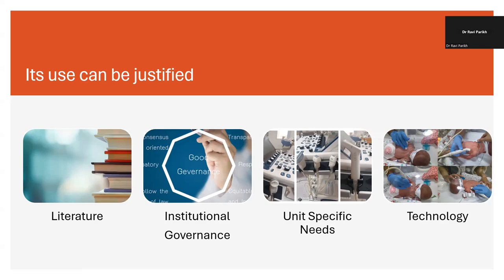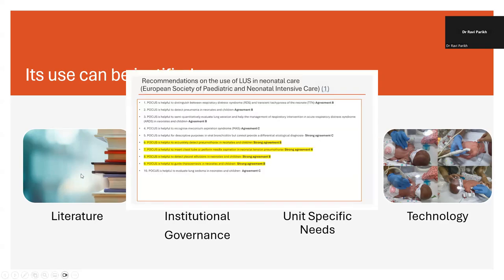And during the training period and even afterwards, if you feel that that's going to justify your use of lung ultrasound, make it easier, keep you protected, then use it. But also remember that there are some areas of evidence that don't necessarily endorse lung ultrasound as a high quality diagnostic tool. And really what I'd say is that that's very well espoused in the guidance for the European Society of Pediatric Neonatal Intensive Care, and that there's absolutely no doubt of its ability to diagnose and treat pneumothoraces and help with insertion of chest drains. In my mind, I don't think you should actually be inserting a drain for effusion without ultrasound guidance. I think the risk is one day you will run into real trouble.